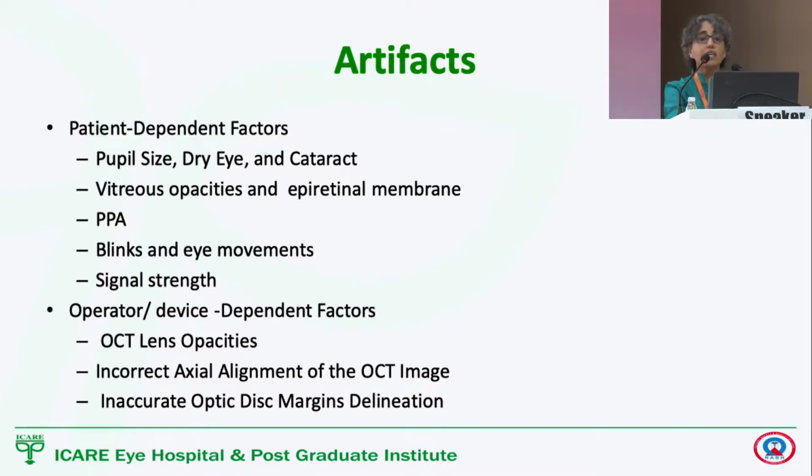Peripapillary atrophy is an important thing to remember to look at, because sometimes when the OCT is picking up the disc margin, it takes the peripapillary atrophy as the disc margin, and hence the calculations of the neuroretinal rim and all are going to be erroneous. So that's important that clinically, when you've looked at the nerve, look at where the peripapillary atrophy is, and when you're seeing the image, you also have the en-face image on the OCT. Make sure that the machine has detected the optic nerve head borders correctly, and I'll show you a printout again to show that.